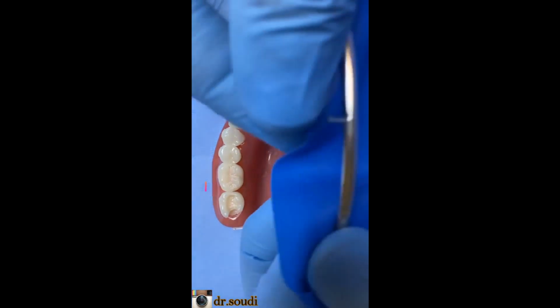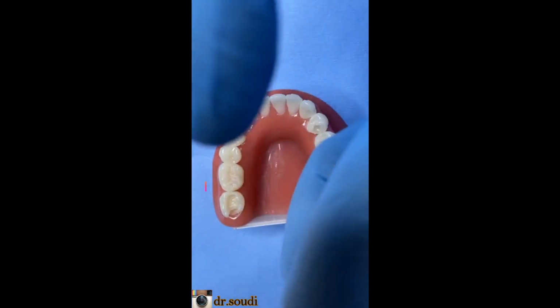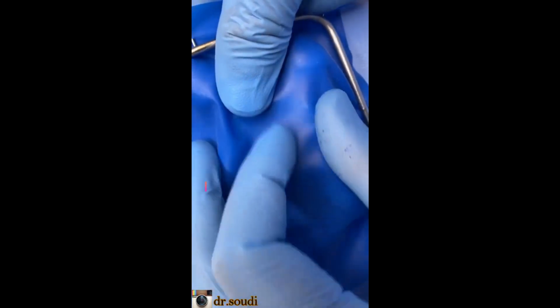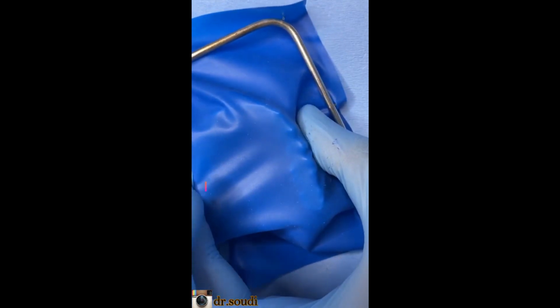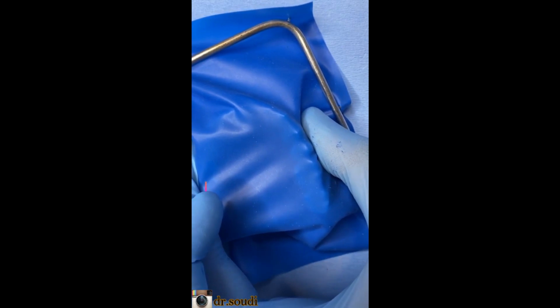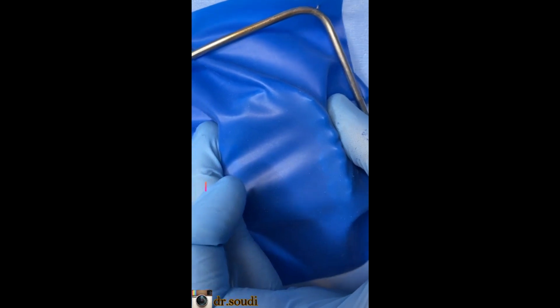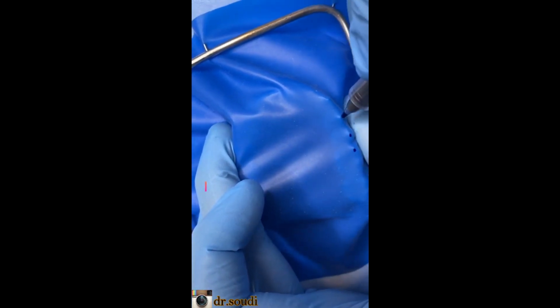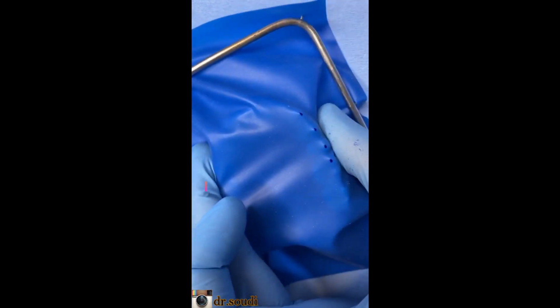As we said, you should fix your sheet to all the projections when you are making the holes like this, and stretch. You can use the template. I mainly use the template, but if I have a spacing patient, a crowding patient, I use this technique. Okay, like this.